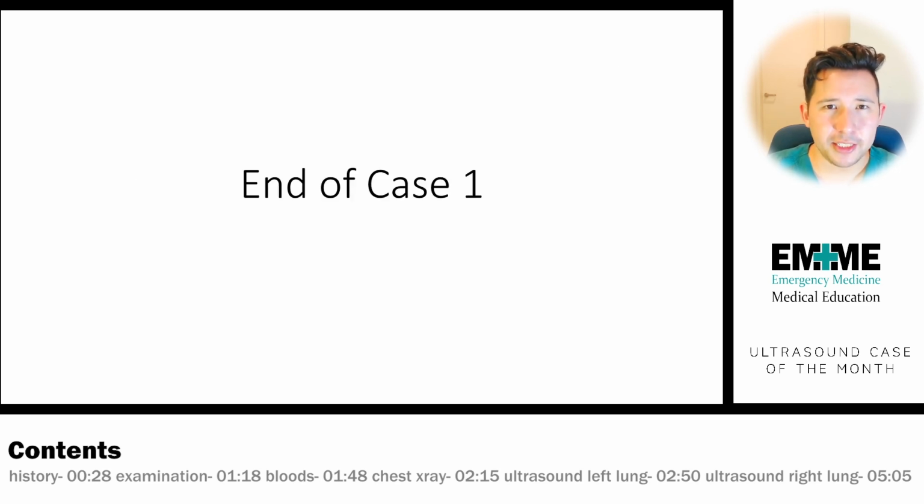So that's the end of the case. I hope you've enjoyed it. I hope you had a good time reading and watching and looking at the videos of the ultrasound scans. And I hope that if you found some of these same findings in one of your own scans, you'd be able to apply them and interpret them in the same way that we've done today.